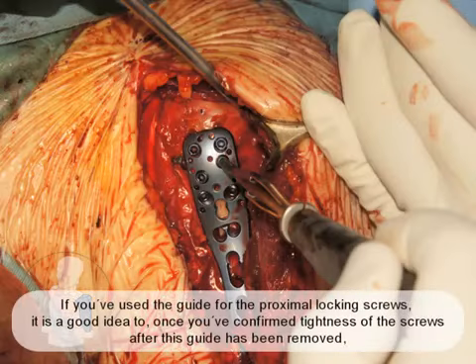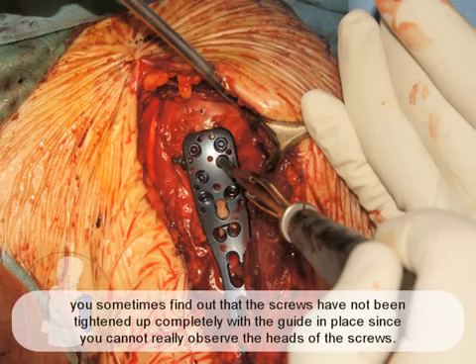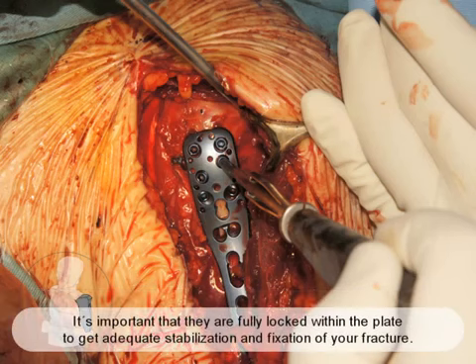If you've used the guide for the proximal locking screws, it is a good idea to, once again, confirm tightness of the screws after this guide has been removed. You sometimes find that the screws have not been tightened down completely with the guide in place since you cannot really observe the heads of the screws. It's important that they're fully locked within the plate to get adequate stabilization and fixation of your fracture.